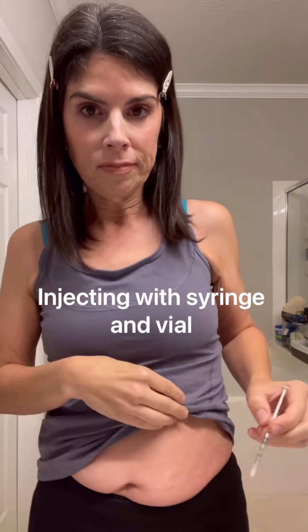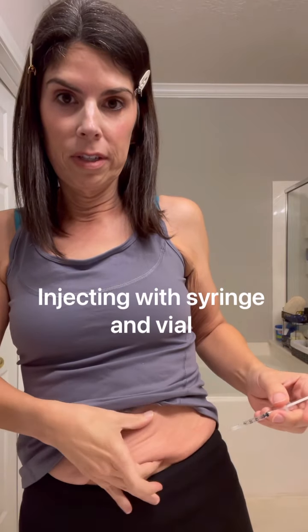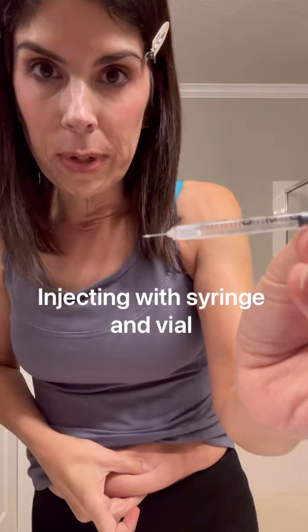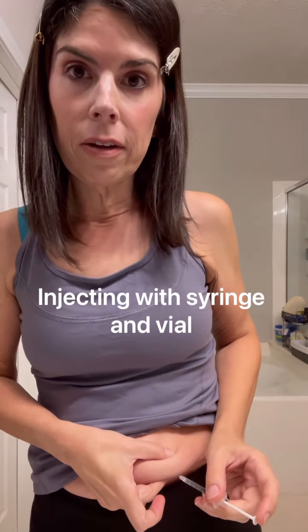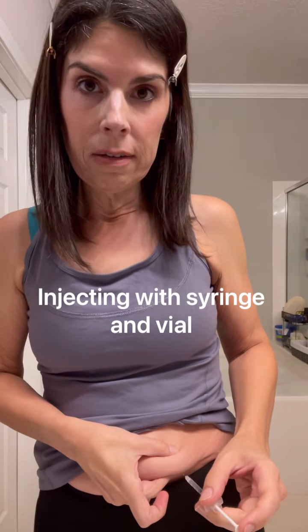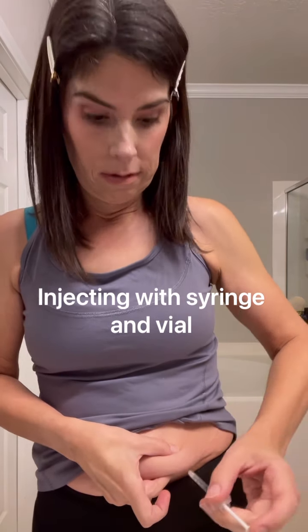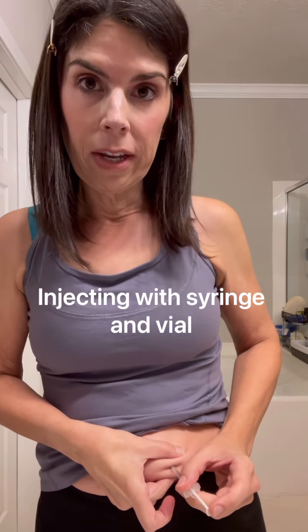Now for the injection. This whole area is clean and ready. It is easier to pinch the skin with these larger needles. Pinch the skin and go straight in — not at an angle, but straight and perpendicular to the skin.